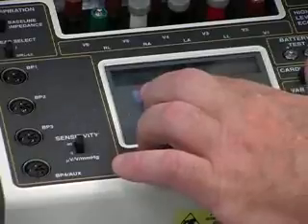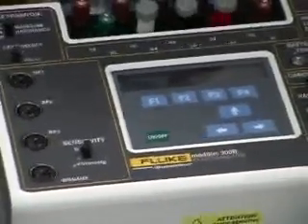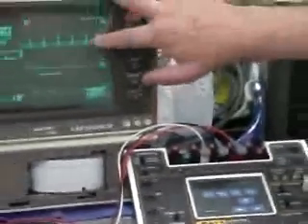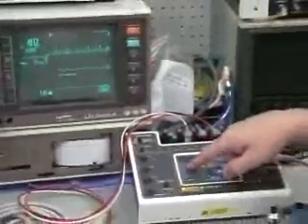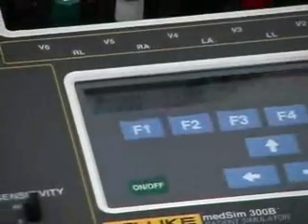So it'll take what we have in the adult ECG here, decrease the PR interval, and also make the R wave narrower, so it is more like what the babies run.